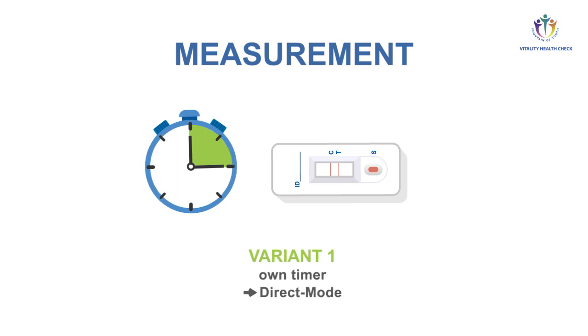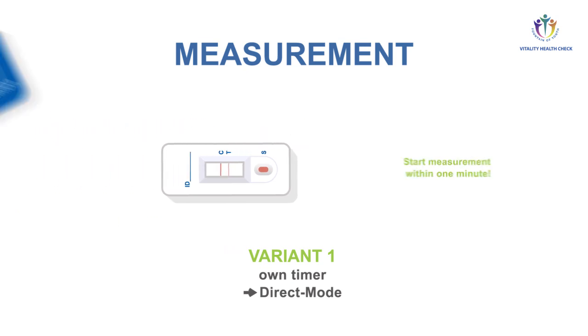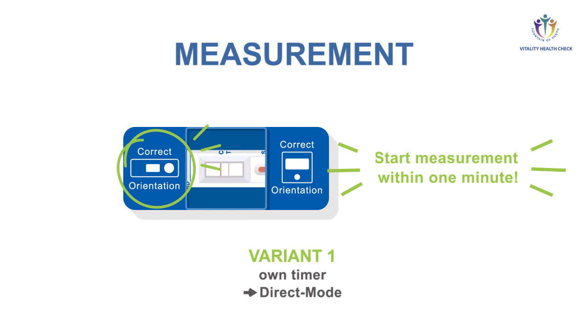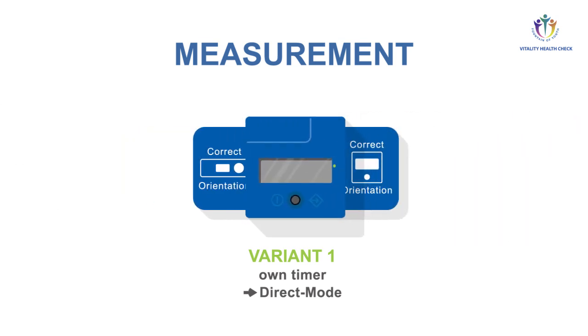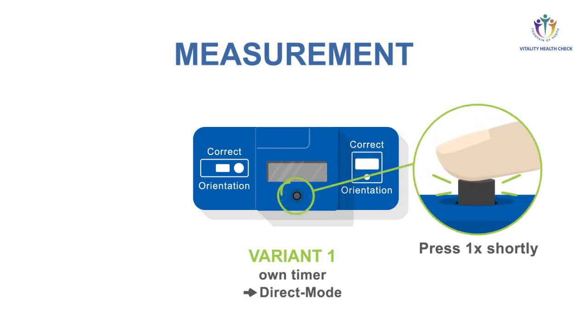In variant one, measurement with your own timer and VHC reader in direct mode, perform these steps exactly after 15 minutes. Place adapter on the test cassette. Place VHC reader on top of the adapter. Check for correct orientation. Turn on the VHC reader by briefly pressing the button.